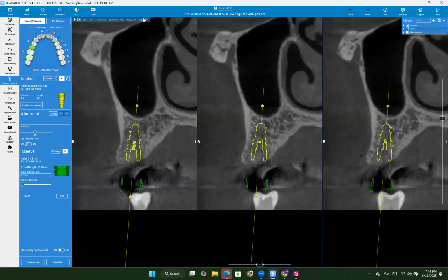And what if I am not able to remove that soft tissue? Would that affect the osseointegration? So what I would do is, when you're prepping the osteotomy there, go in and curette the apex and make sure you don't have any soft tissue there. You should be able to remove it with your surgical drill. As you're drilling, you will generally be able to remove some of it.